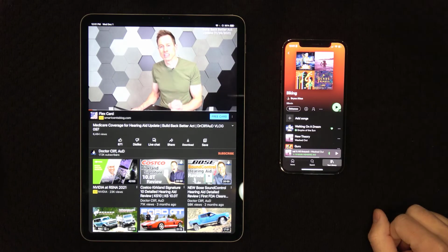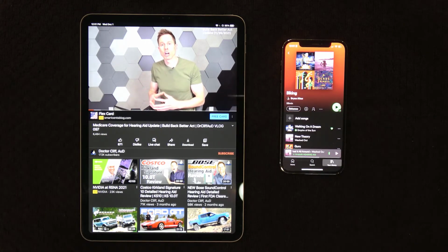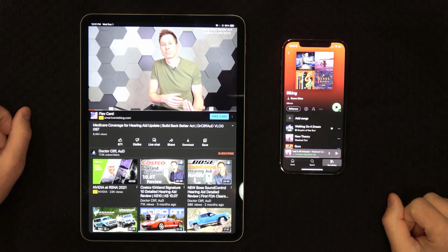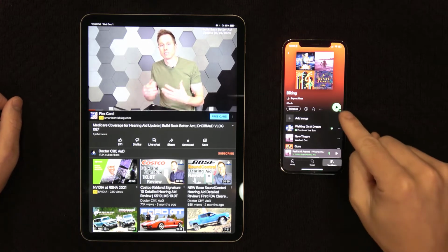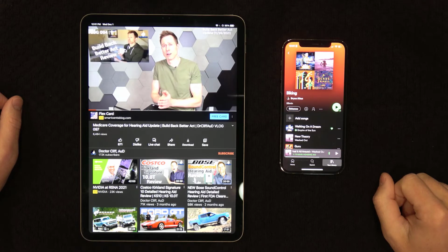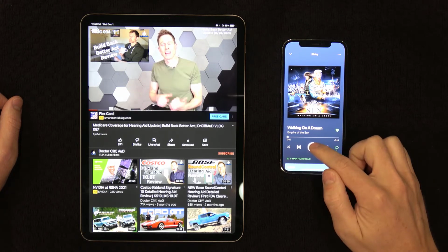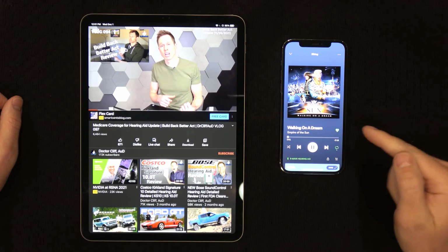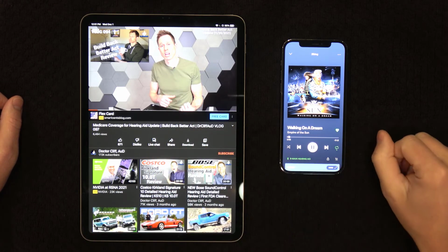For example, let's say you're watching a video or YouTube on the iPad and streaming audio from that video into your ears through your hearing aids like I'm doing right now. Now, let's say you want to go on a walk and start listening to music from your phone instead of the iPad. When you are connected to both devices and you start playing music on your phone, you will begin to hear the audio from the phone being streamed into your ears through your hearing aids, and the video on the iPad will automatically pause, thus stopping the audio from the video on the iPad.